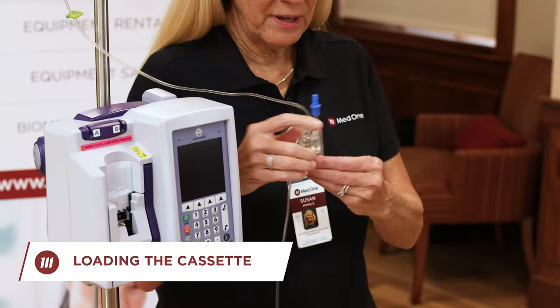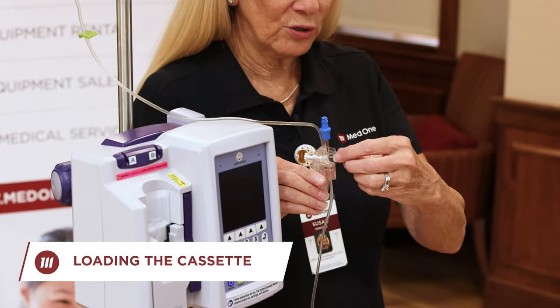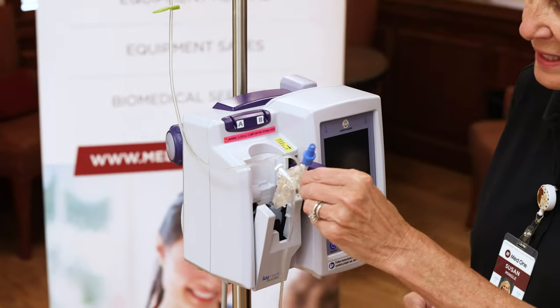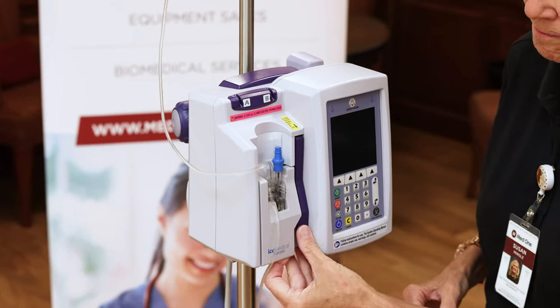Now we're going to load the cassette into the device. Grab hold of the finger grip on the back, open your lever, and slide the cassette into the door. Close your lever, and now we're ready to program an infusion.